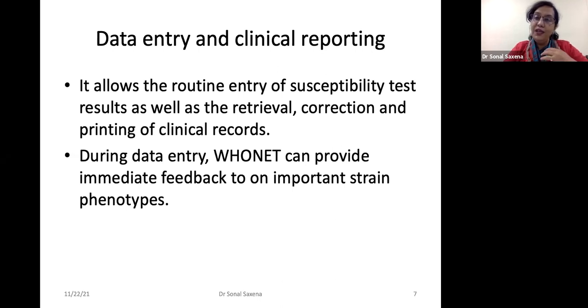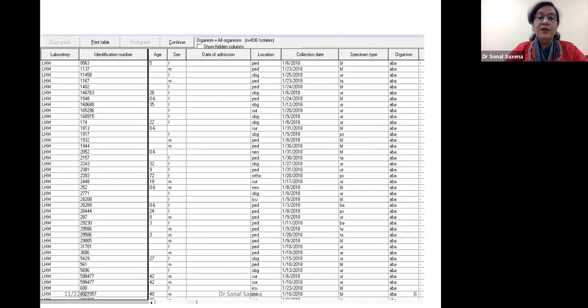And then those PDFs we could directly mail to our clinicians or send them on WhatsApp groups, which is one to one, so that they don't get leaked out to the public. So we had made specific mailing groups in order to send these to, say, surgery or medicine or ICUs and so on and so forth. So we used it at that time to create this.